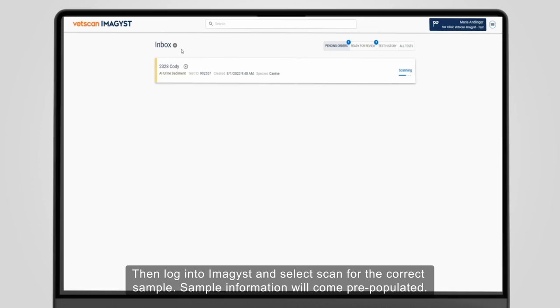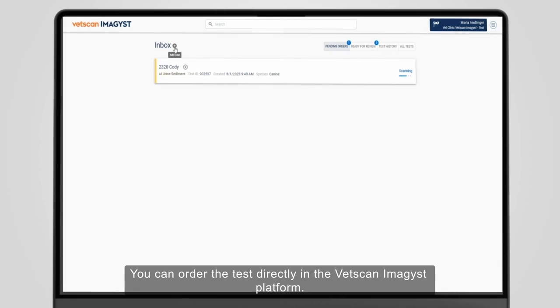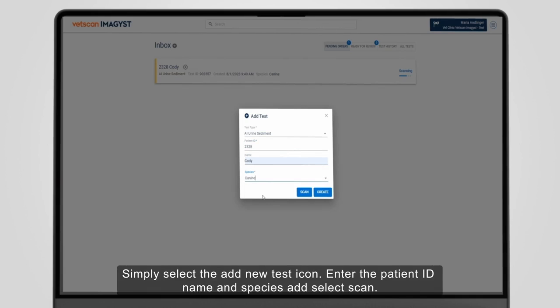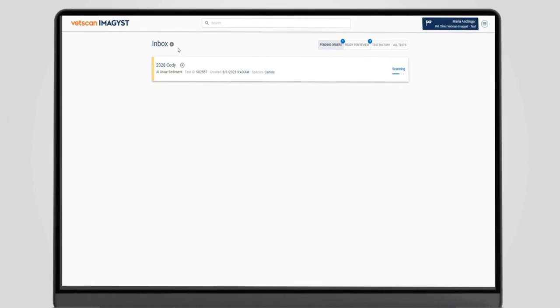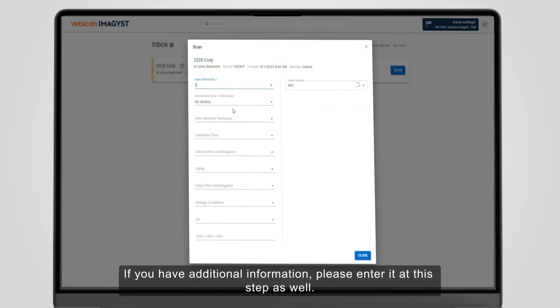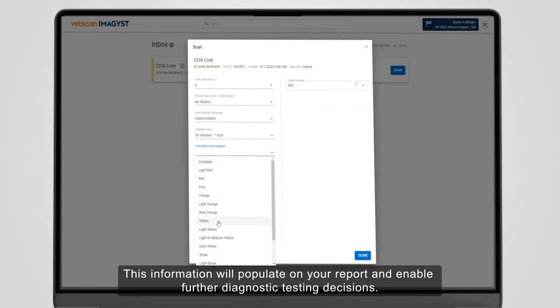If your software is not connected to Fuse or you do not use software, you can order the test directly in the Vetscan Imagist platform. Simply select the Add New Test icon, enter the patient ID, name and species and select Scan. Choose the volume used as well as the dilution ratio if applicable. If you have additional information, please enter it at this step as well. This information will populate on your report and enable further diagnostic testing decisions.